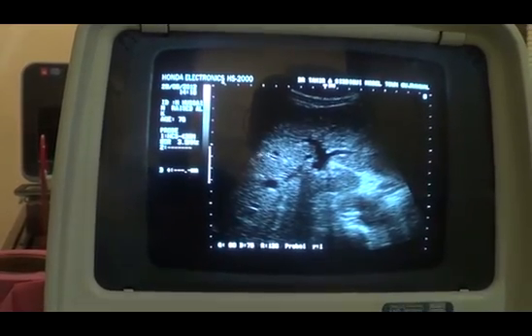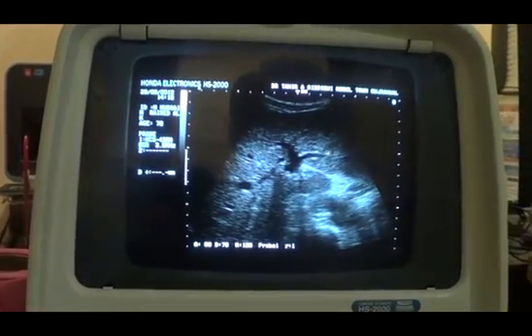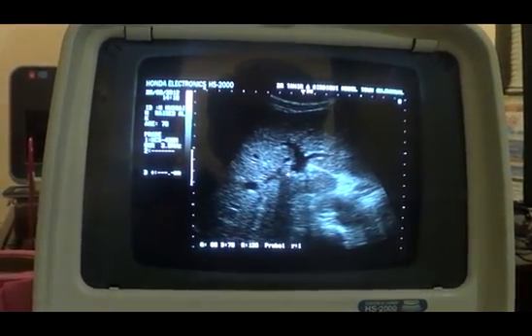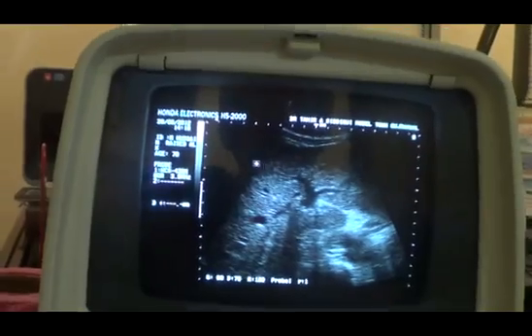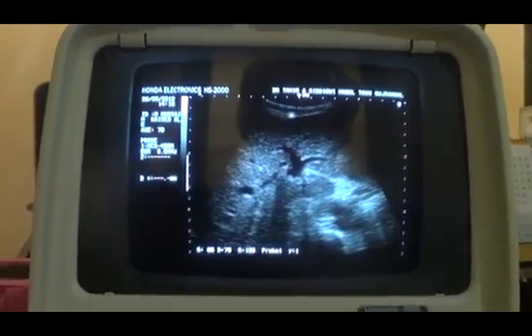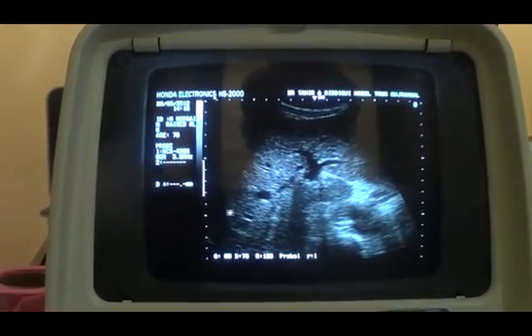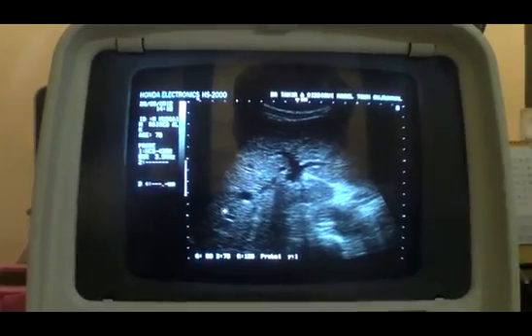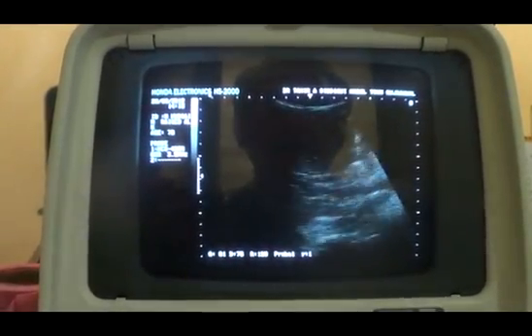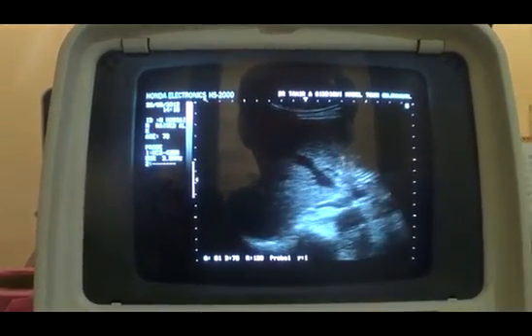The echotexture of the liver is slightly decreased because the periportal echoes are seen raised. So slightly decreased parenchymal echogenicity of the liver with homogeneous texture. This is the outer surface of the liver, which is smooth and regular. So in fact, there is no significant intrahepatic bile duct ectasia seen so far.